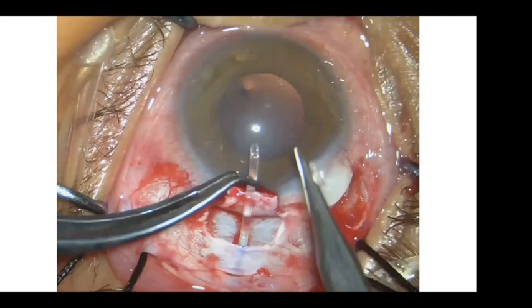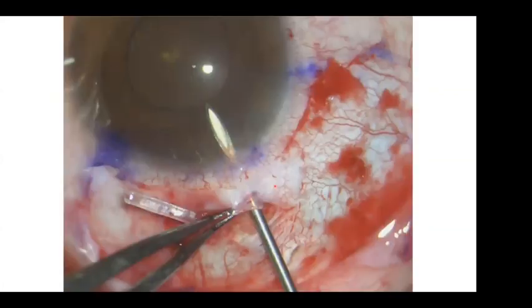Now, while doing that, the remaining part of the tube is short, because in the old days, when I put the implant like 8 millimeter, the tube is around 20 millimeter. So I find a long part of the tube to cut. But once I place the implant posterior, the remaining part of the tube is usually not too long. I make it beveled, and then we pierce the limbus using the 23 gauge needle. We can have this needle connected to Healon, so that once you inject Healon, it will fill the anterior chamber and lubricate the entry site.